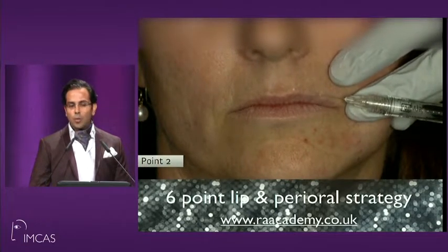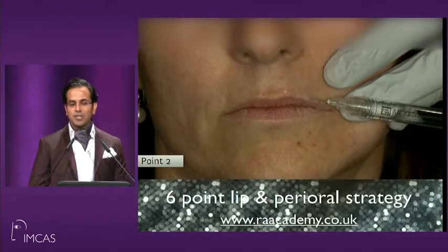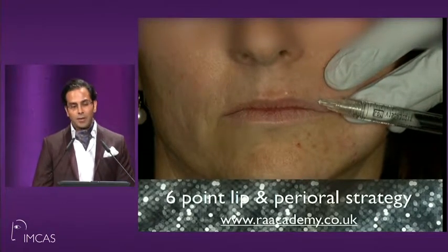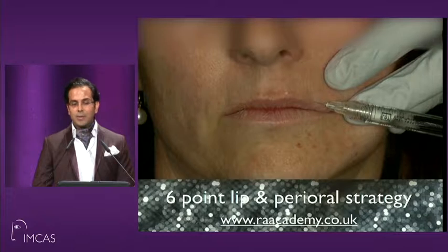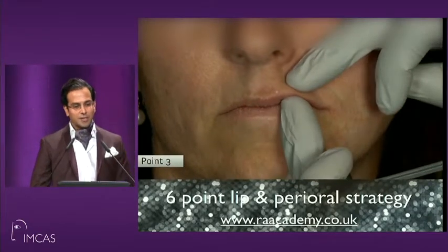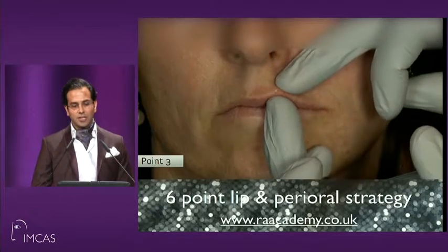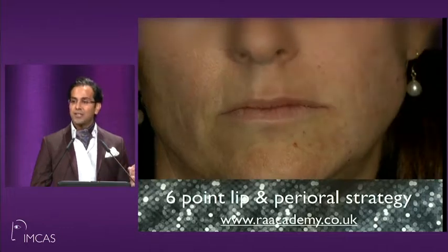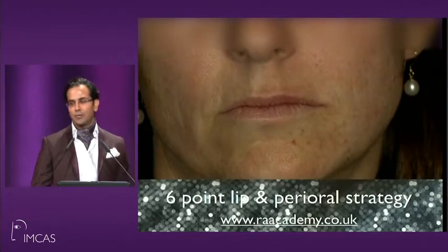So look how I'm in the white part of the vermilion here. I'm not injecting in the red tissue. It's barely subcutaneous injection. And I want to leave a little bit more medially and less laterally, like a comet tail type of effect. And I mold and massage the tissue here, conform it to the vermilion. And now I'm showing more red tissue on the left than I am on the right.